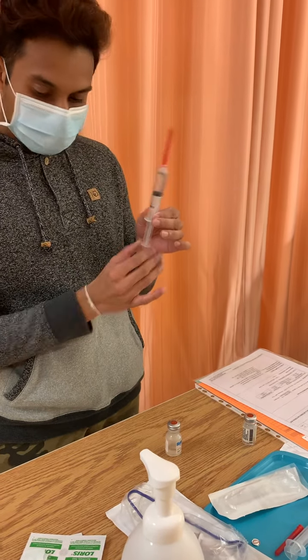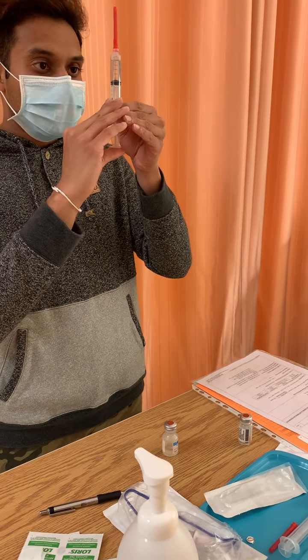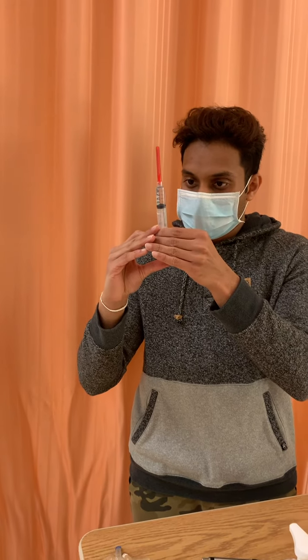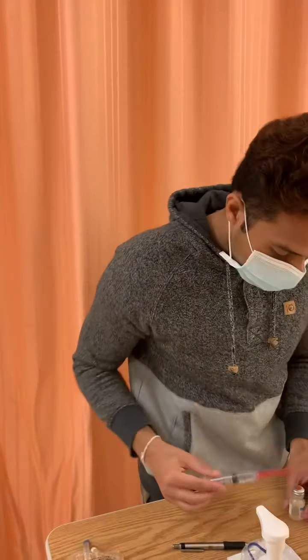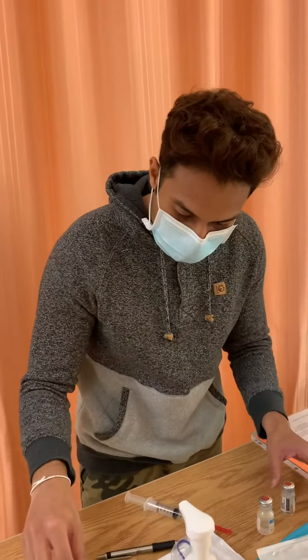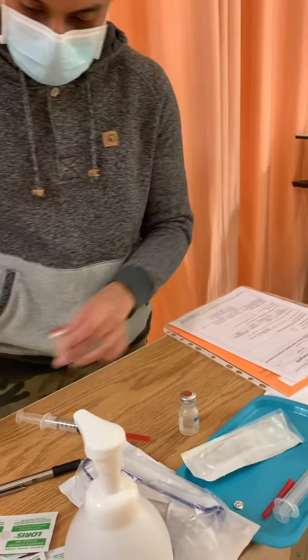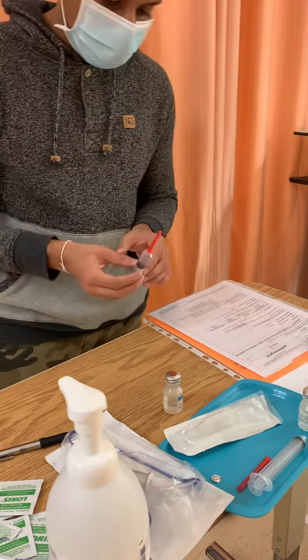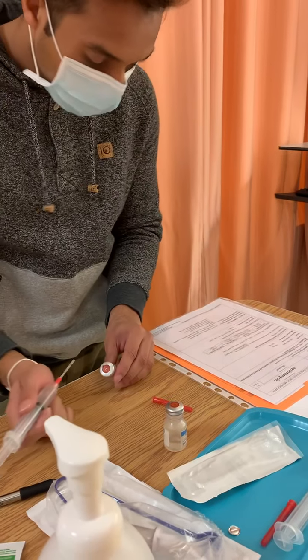We're drawing back, and we're doing this over the med waste to prime it to 4.8 ml, getting rid of the excess medication. There are no air bubbles, it's all good. 4.8 ml in there. Now we're going to swab this for 30 seconds with a new alcohol swab and let it dry for 15. Okay, and now we're going to inject that 4.8 ml of sterile water into there.